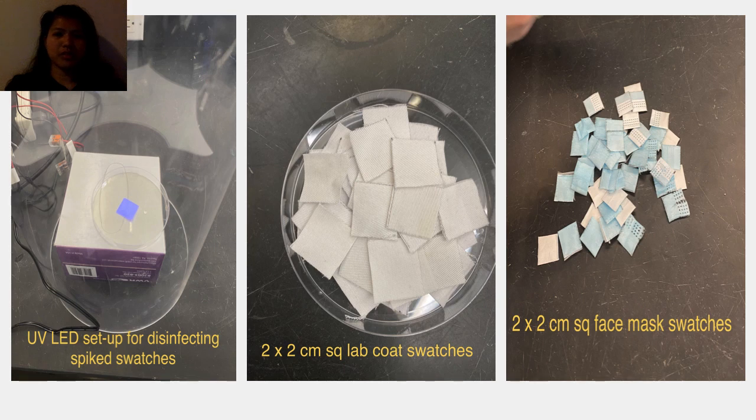This is the prepared materials for the experiment that we did. We cut up the face masks and lab coats and set up the UV LED for 2 wavelengths.